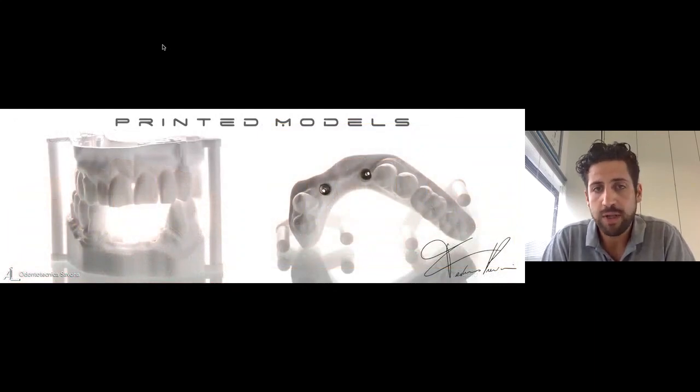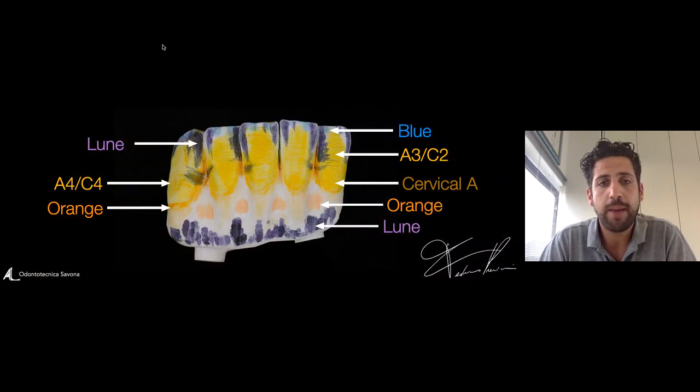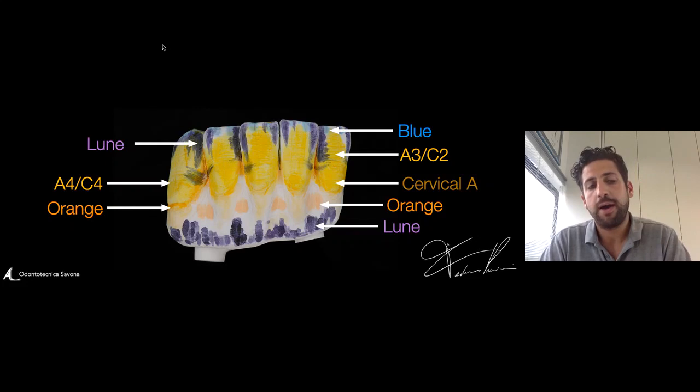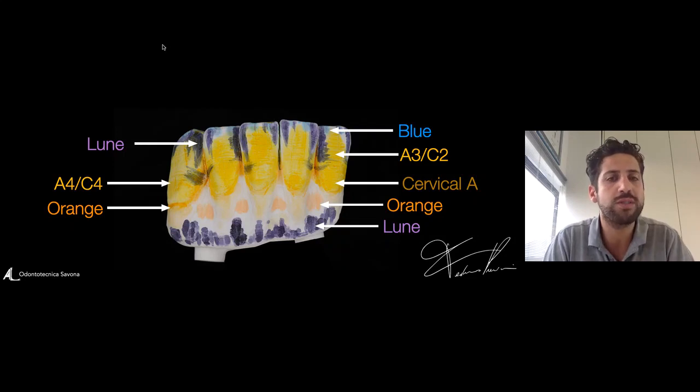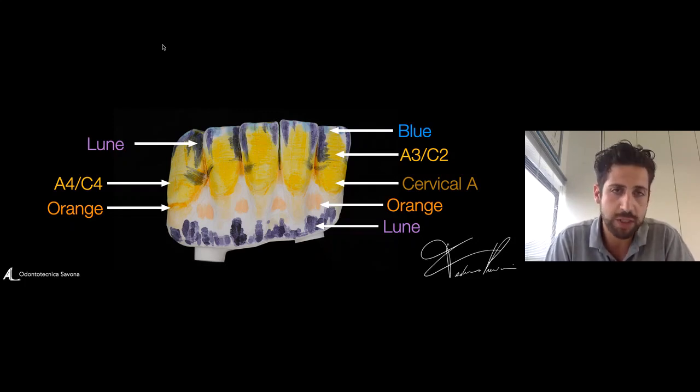Okay, we printed the model. We made a really nice texture in the surface. And we started the characterization of this zirconia. About the zirconia, we milled the Prettau 2 Dispersive A2. And we use, for example, in the incisal edge, to make a really low value color, the lune, this violet effect. For the canine, we use Dentin A4 and C4 for the body.